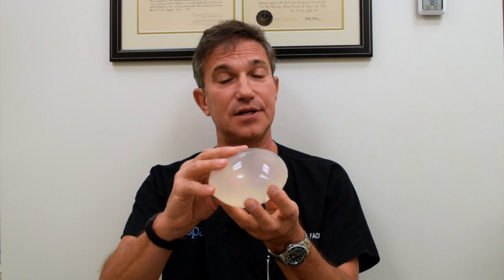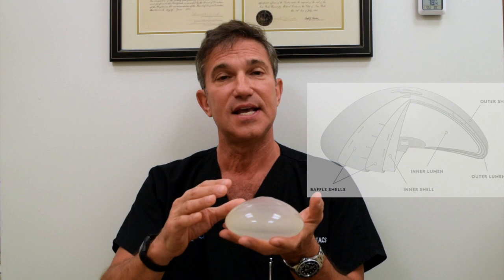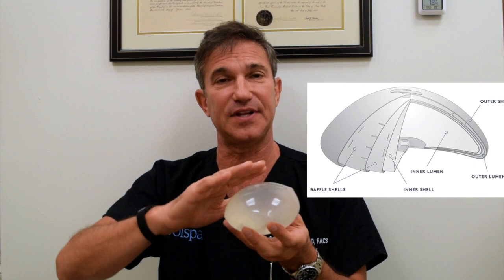What makes this implant unique and why it's called a structured implant is that it has two chambers that hold saline. It also has what's called baffling, which is sheets of silicone — no gel, just a sheet of silicone — and that's all about making the saline move more slowly when you touch it.